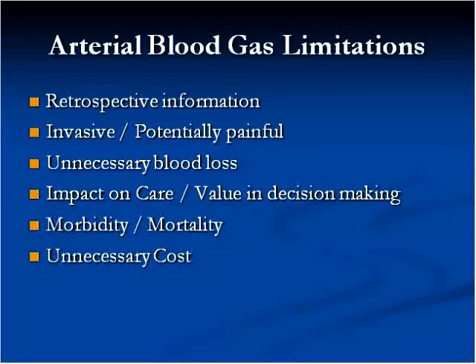Certainly we like the real-time information, but we have not yet found a way to get real-time information with acid base and ventilation, at least not to the degree of efficiency of a blood gas. The blood gases, of course, are the gold standard in those cases. Blood gases are potentially painful if not done correctly, or even if they are done correctly. It is an invasive procedure and certainly carries with it some risk of infection and or blood loss.